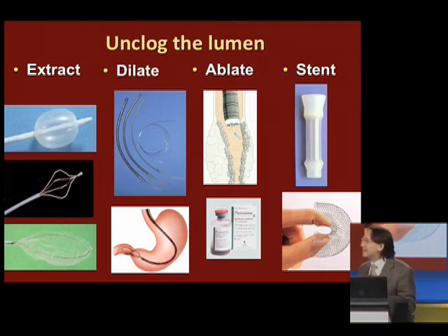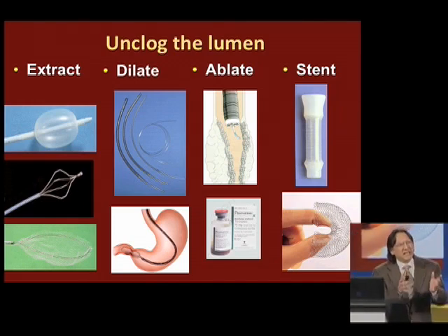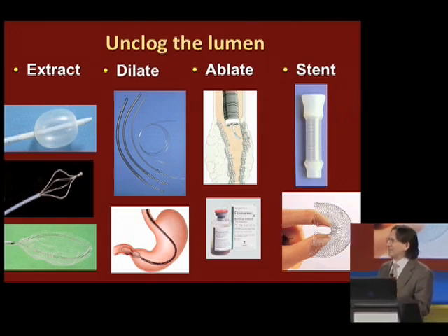What about stenting? Well, that really started as almost a barbaric side note of endoscopy. These plastic rigid tubes had to be placed with general anesthesia with high complication rates. Well, that all changed dramatically with the invention of the self-expandable metal stent.